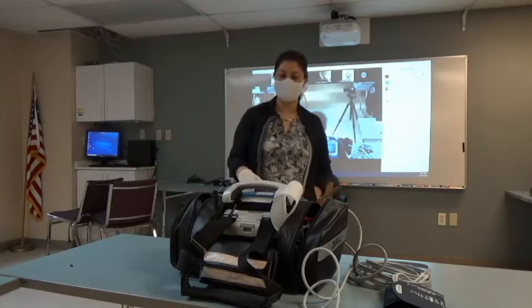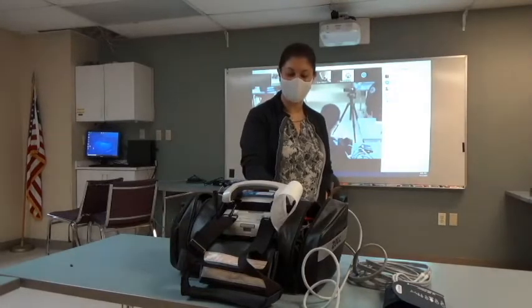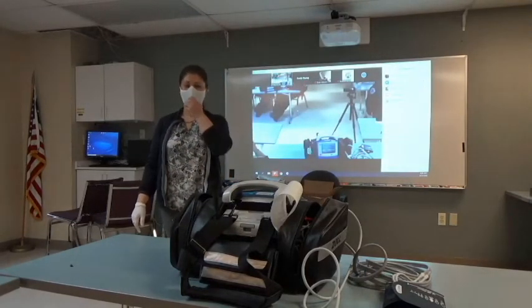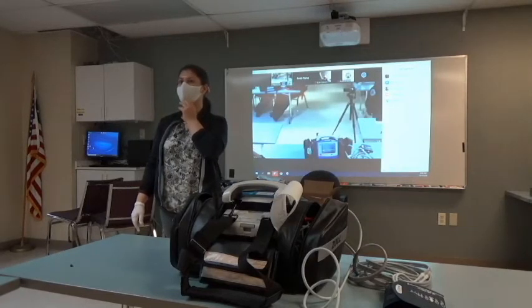Okay, two ways to get out of 12-lead. You either hit your home button or you hit your exit 12 button. What do you want to do? We're going to exit out of 12.